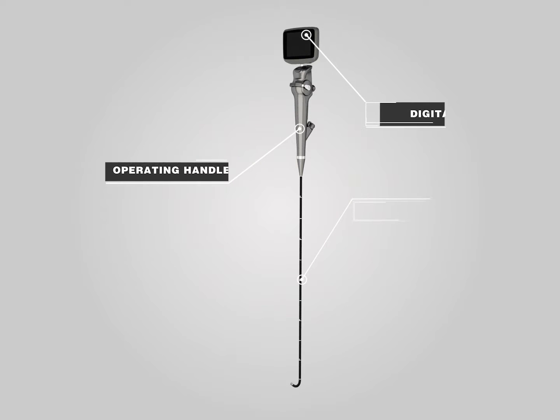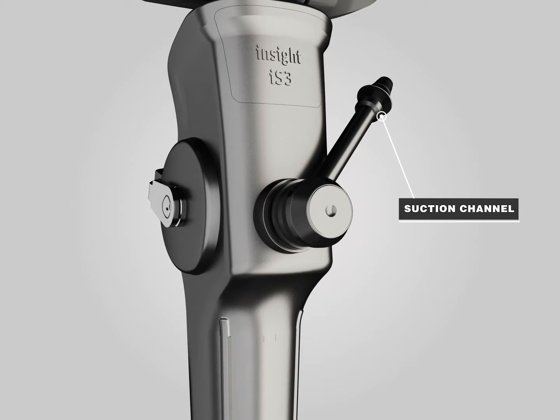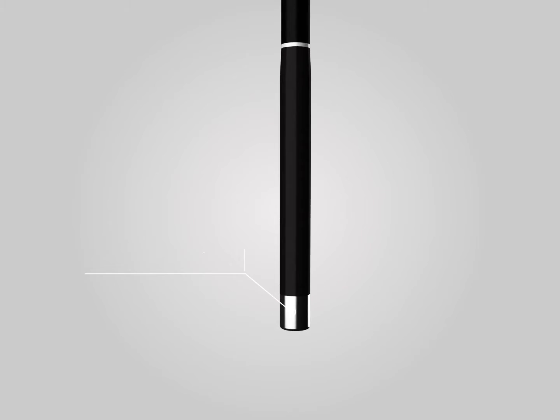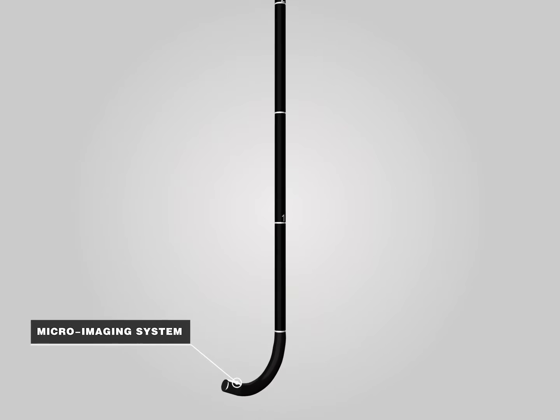The INSIGHT IS3CF Video Flexible Laryngoscope consists of a monitor, operating handle, and insert tube. There are suction and medicine channels in the operating handle, which are used for medicine delivery and biopsy. The front view can be adjusted by an adjustable lever. In the front of the tube is a high definition micro-imaging system, which is the core component of the IS3CF.